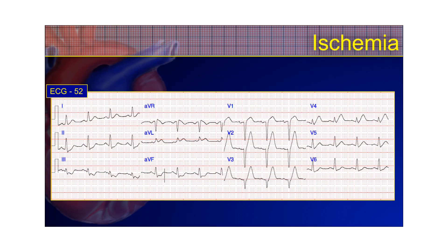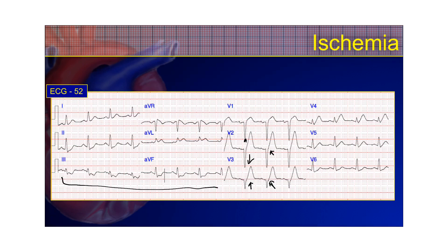Here's another example of hyperacute ischemic T-waves — this is an early anterior wall infarction. You should be able to identify that these T-waves are very tall and symmetrical, not proportionate to the QRS complex they belong to. We do see reciprocal changes in the inferior leads, so this patient would likely become a STEMI. This particular T-wave is what we would call a De Winter T-wave, due to J-point depression in the anterior leads. If you see J-point depression with a big hyperacute T-wave, that's called a De Winter T-wave.